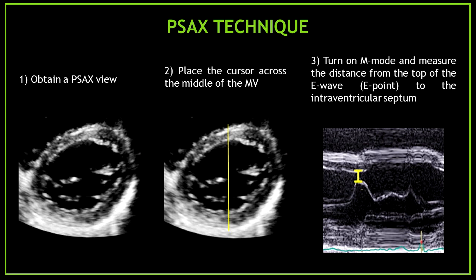Let's review the parasternal short axis technique to obtain the mitral valve E-point septal separation — three simple steps. Number one: obtain a parasternal short axis view at the mitral valve level. Number two: place the cursor across the middle of the mitral valve. Number three: turn on M-mode and measure the distance from the top of the E-wave, which is the E-point, to the septum.